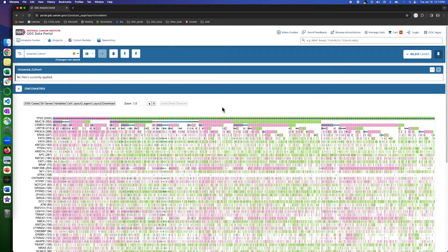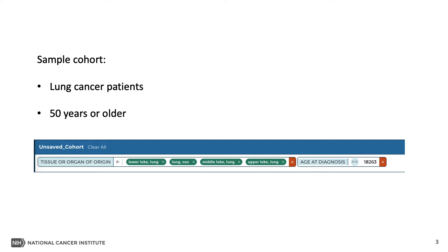To demonstrate the tool here, we are using a sample cohort that contains lung cancer patients who are 50 years or older. We have named this cohort LUNG50+. We have videos on creating and using cohorts, and if you haven't already seen those, we encourage you to watch them to see how cohorts are created.